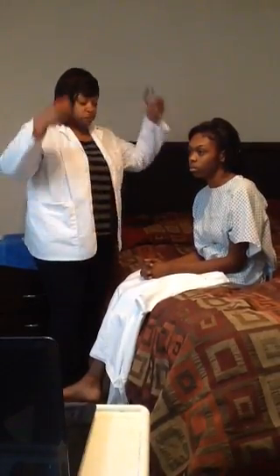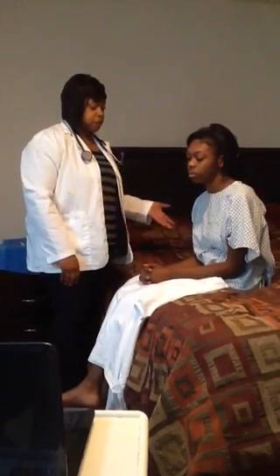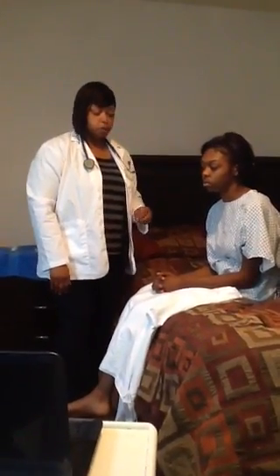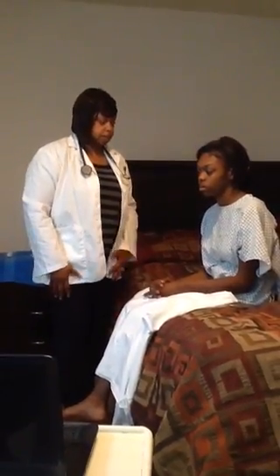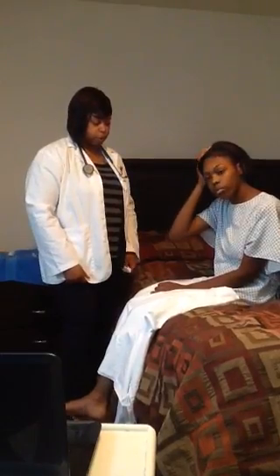And then I would make sure the room is very quiet. I would either have the patient lean forward or have them lay on their left side, change my stethoscope to the bell, and repeat the same sequence using the bell of my stethoscope, listening for S3, S4, or murmurs.